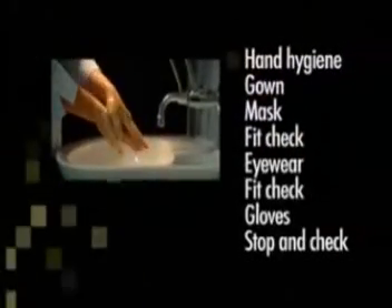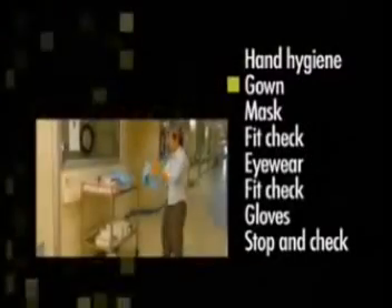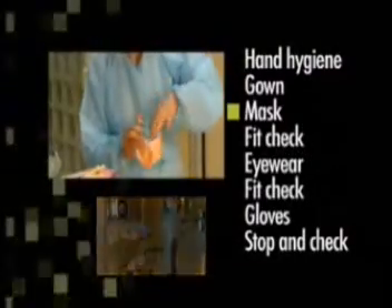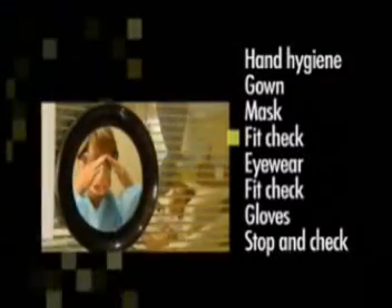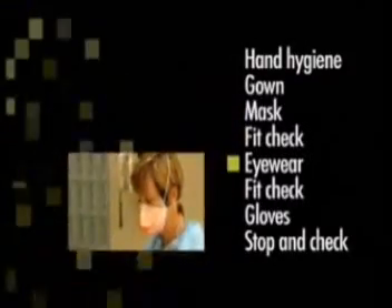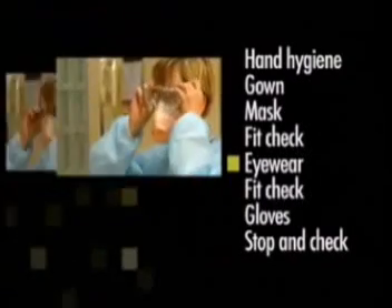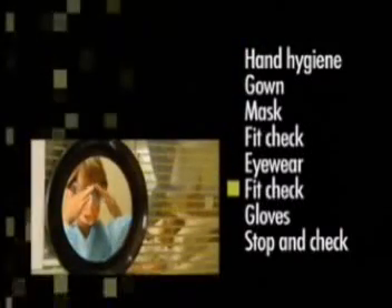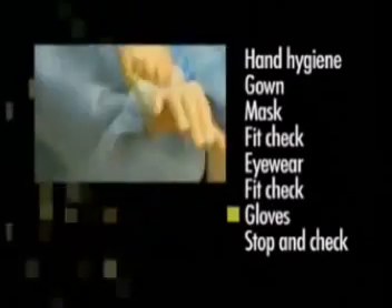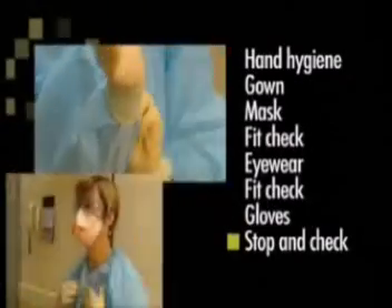The sequence for putting on PPE is as follows: perform hand hygiene, put on your gown, put on your P2 or N95 respirator mask, fit check your mask, put on your protective eyewear, refit check your mask, put on your gloves, then stop and check that everything is in place.